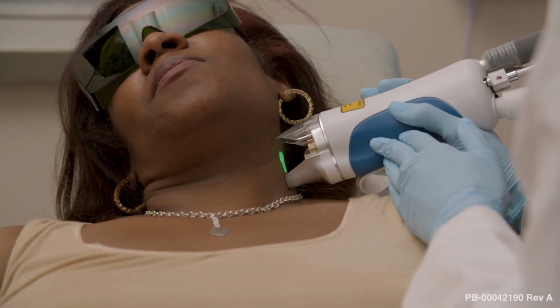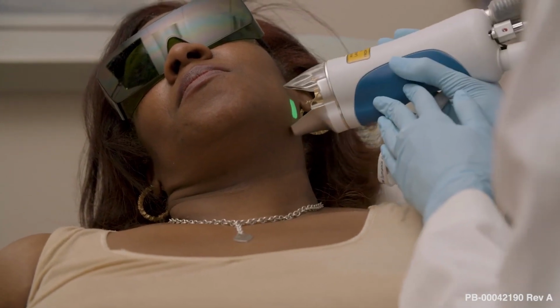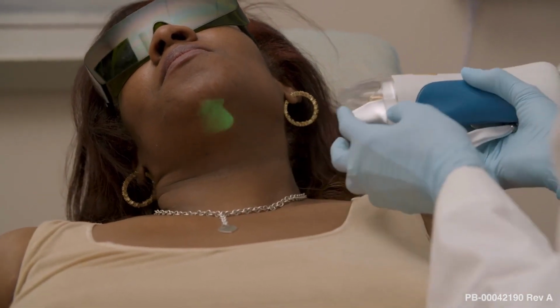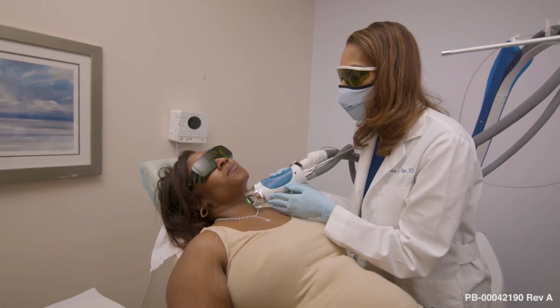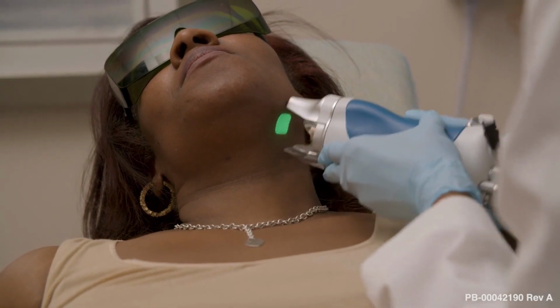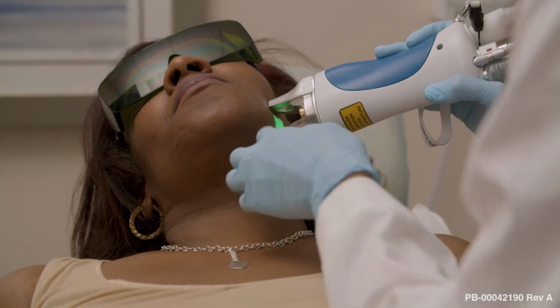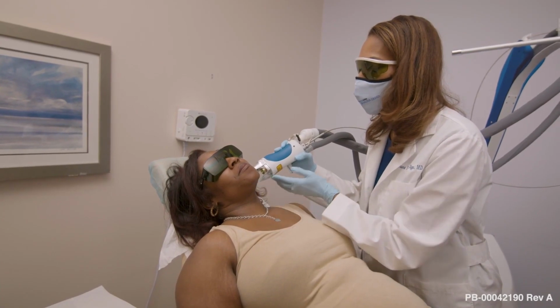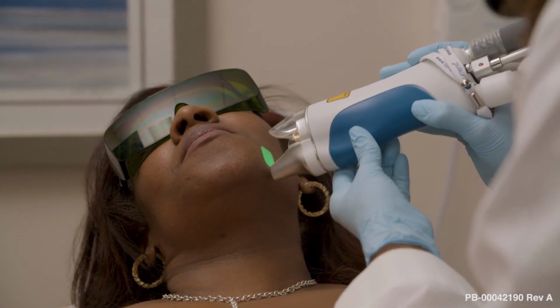I'm looking at my squares. You see the light, so it helps me map where I am. So for the contact cooling, you can reverse it each time so that it cools the area that you're about to treat next. You want to try to have these 2 points flat at all times. If you're over a curved area, sometimes I'll just make sure that I'm aware of the plane because you want it perpendicular. You can rotate again, cool, then begin.